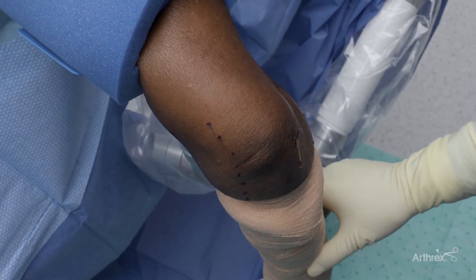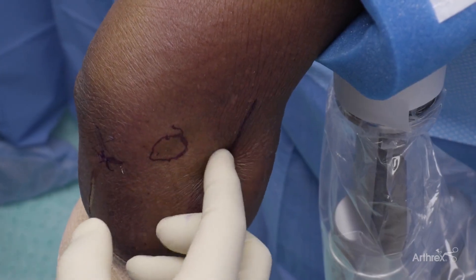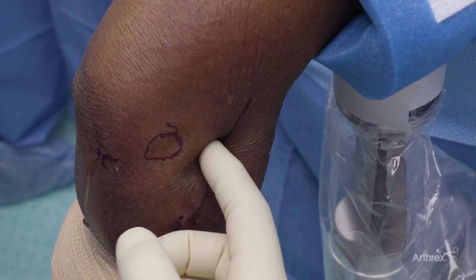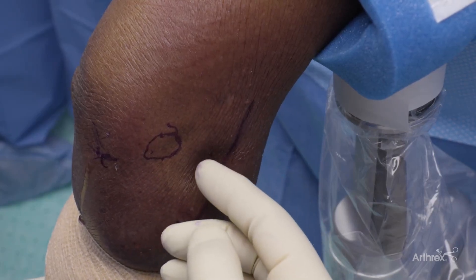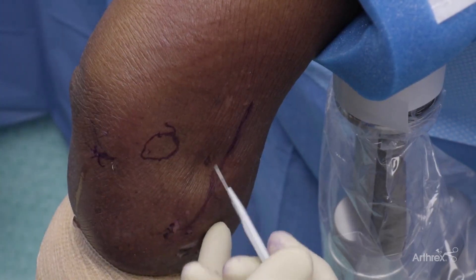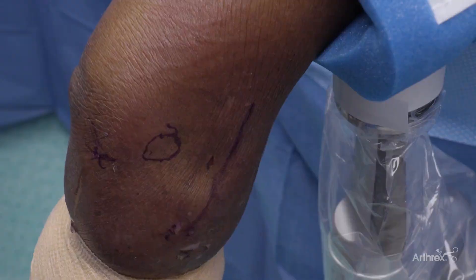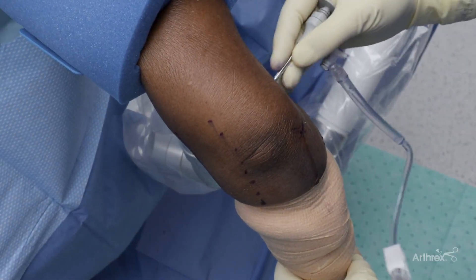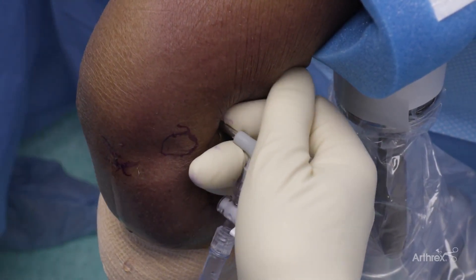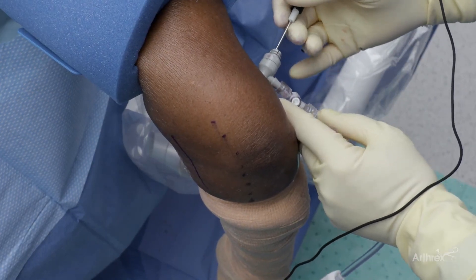The first working portal that I utilize is the radial portal. You want to feel for the radial head and come just anterior to this. You want to make sure that you're working in a plane that you're not fighting your radiocapitellar joint in the skin. One of the beauties of the nanoscope is that you really need minimal skin incision. Then what we can do is place our trocar and feel for the radiocapitellar joint. I can feel I'm in the joint, and here we are in the joint very easily.